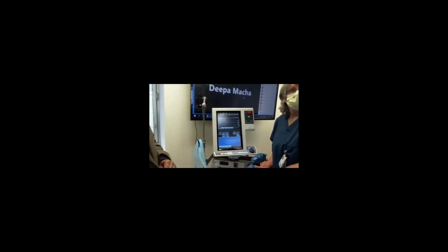Thank you. Would it be possible, there were some initial settings and you made some initial adjustments, when you're first getting onto the unit, to have at least some initial settings number-wise in terms of an initial goal for the patient? Obviously, there'll be adjustments, but to have those initial settings in hand when you're doing this might be helpful.